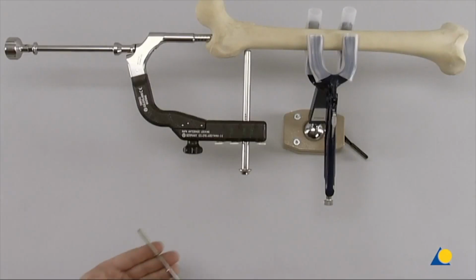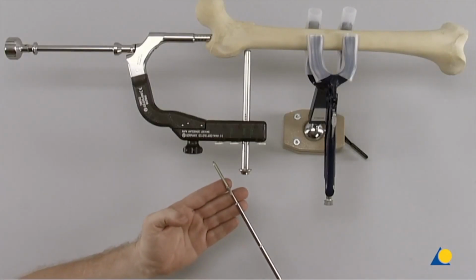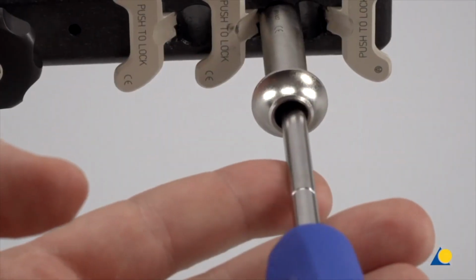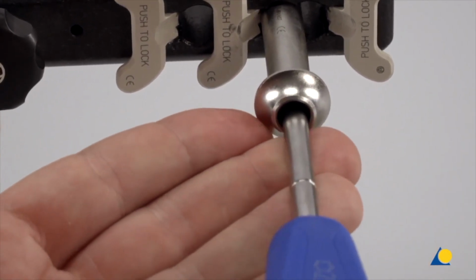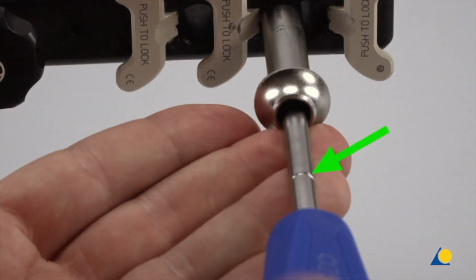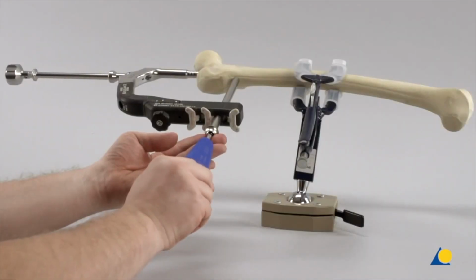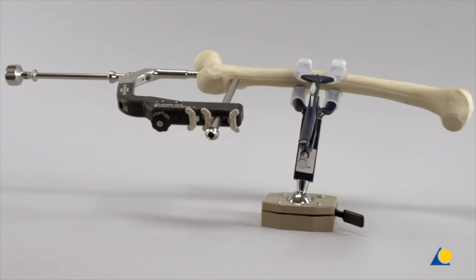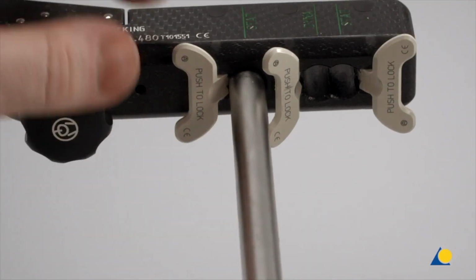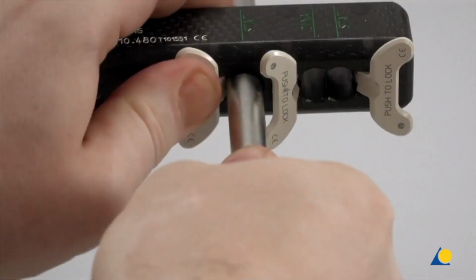The self-holding star drive screwdriver T25 is used to insert the appropriate 5.0 mm locking screw through the protection sleeve. Note that the groove on the screwdriver shaft indicates the end of the screw. This screw insertion procedure is repeated through the cranial lateromedial hole.